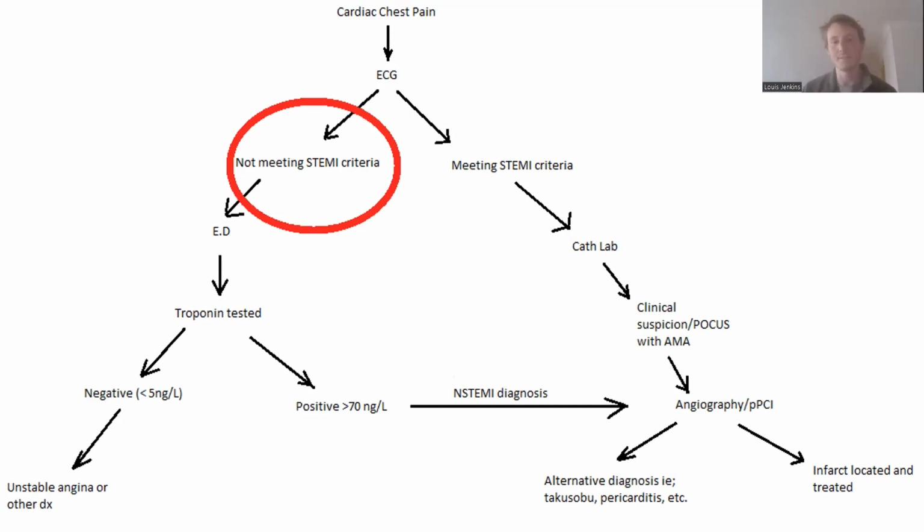There is a large subsection of patients that we are routinely dismissing as NSTEMIs who are missing timely reperfusion because their diagnosis of myocardial infarction required an A&E admission and troponin testing to determine they were infarcting. Now, within this subsection of patients, there is a percentage of them who presented with initial ECG findings that were diagnostically equivalent to the patient having presented with a STEMI, okay? So I get that that was pretty wordy and maybe a bit to understand, but we are going to break that down. But that is the crux of everything we want to talk about today, okay?